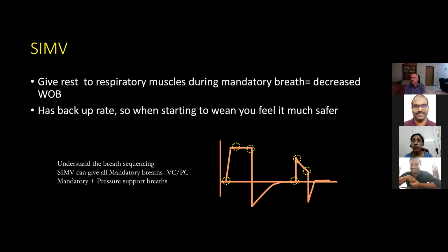You think that when the patient doesn't breathe, there is a backup rate, so the patient will not go into apnea. That is your understanding. I've been teaching mechanical ventilation for 20 years. Whenever I ask the junior colleagues, they always say during a mandatory breath, the patient can rest, and when he doesn't breathe, there are mandatory breaths. There is a backup rate. This is your understanding, isn't it? So let us see, is it true or false?